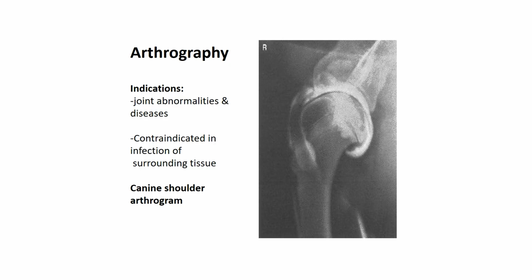Now another contrast technique related to orthopedics is arthrography. Arthrography is a contrast technique used for the diarthrodial joint. It is indicated for any type of joint abnormality, joint disease, etc. But it is contraindicated in the case of septic arthritis, or any infection near the joint.